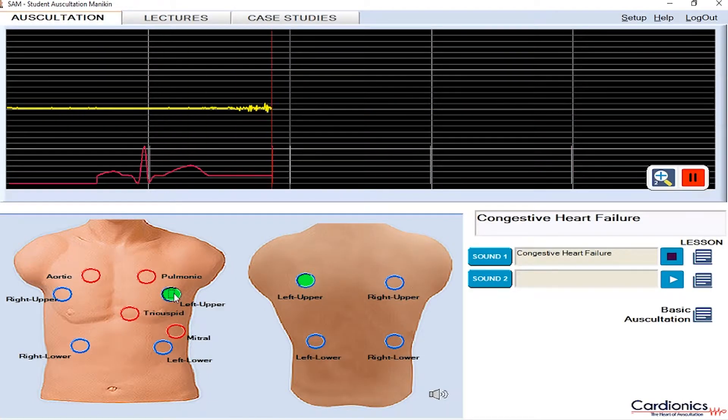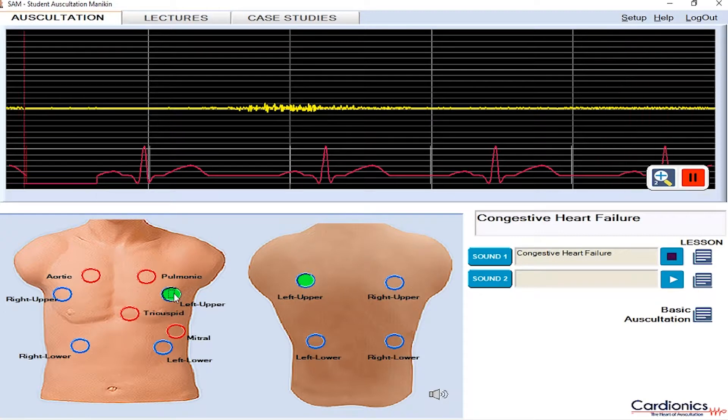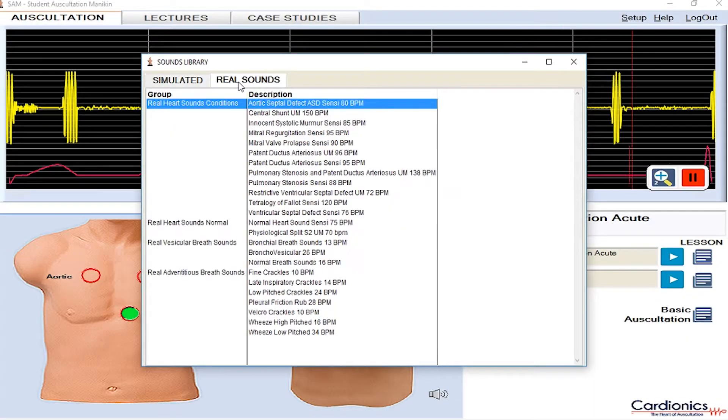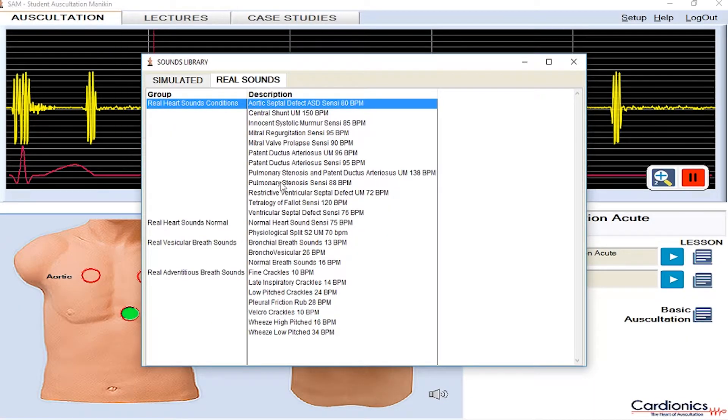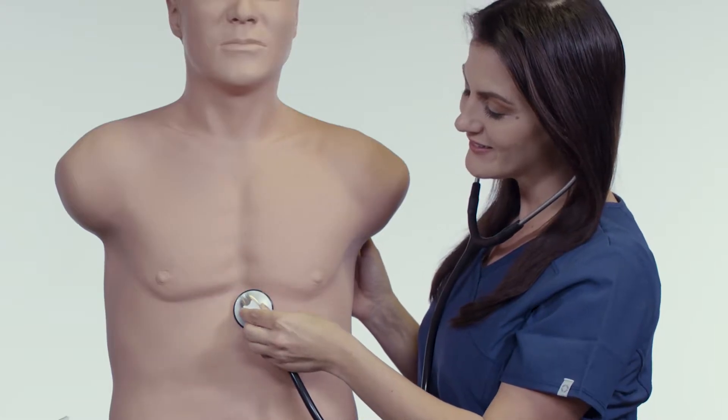Providing the clearest, most accurate sounds in the industry, SAM 3G contains over 100 normal and abnormal cardiac, respiratory, and bowel sounds. And with SAM 3G, you'll have access to our Real Sounds library, which contains 24 distinct sounds recorded from live patients.